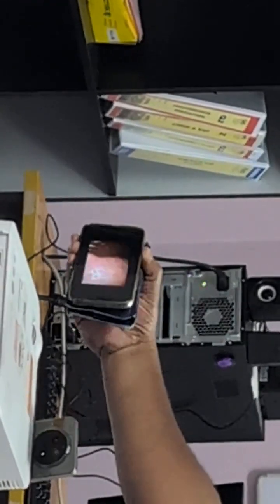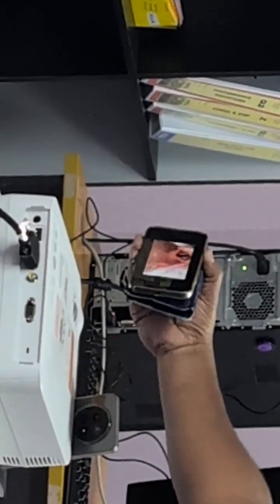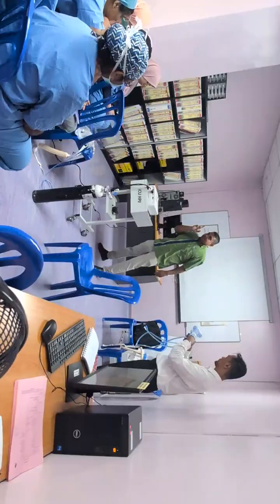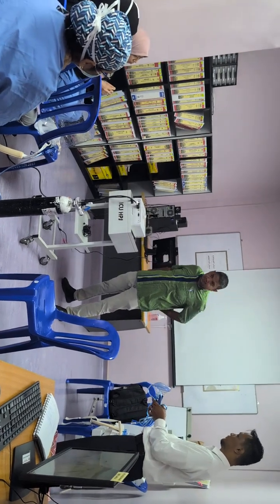This is invasive, this is a video laryngoscope. This is not CPAP. Okay? So you see, the moment we were ready, we went in. You see that? Nice? Done. Next door, what was the name again? Dr. Asli. She used this. She was challenging me. 14 seconds from introduction to insertion. 14 seconds. She turned on. Okay, all right.